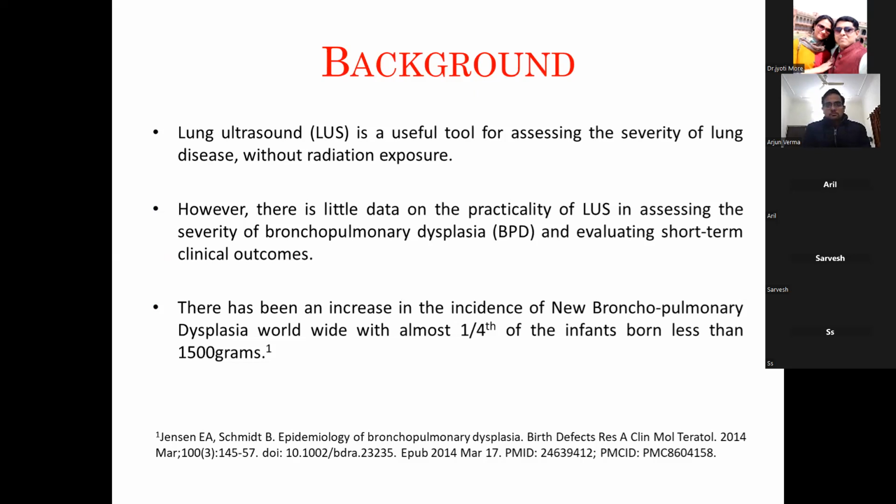There is little data on lung ultrasound for evaluating BPD and its short-term clinical outcomes. As we know, with the increase in survival of premature babies, there is an increase in incidence of BPD also. Recent articles show 1/4, like 25%, incidence of BPD in premature babies less than 1.5 kg.